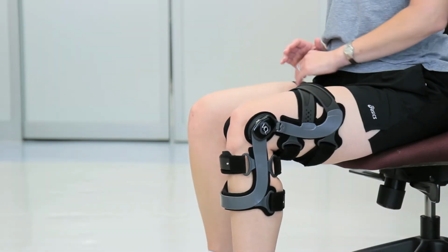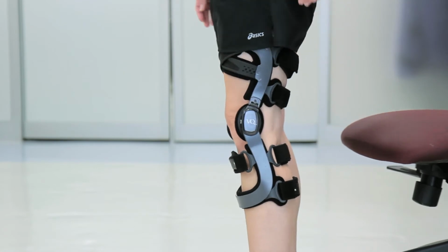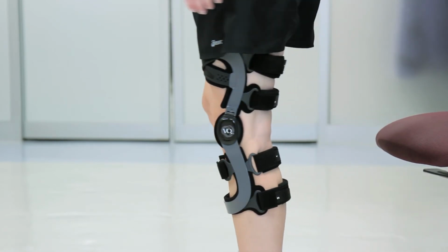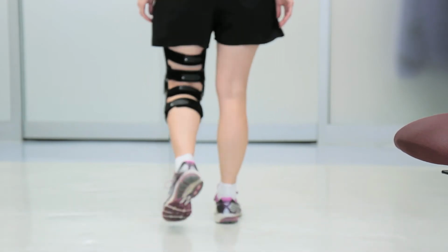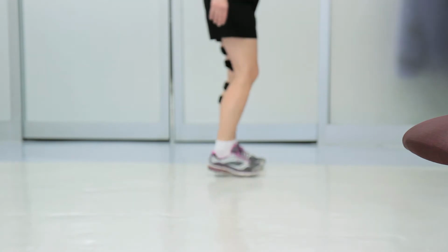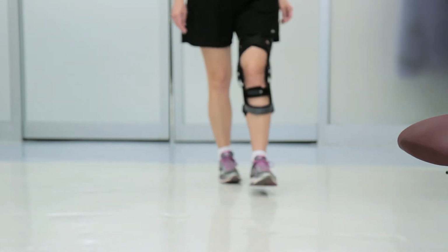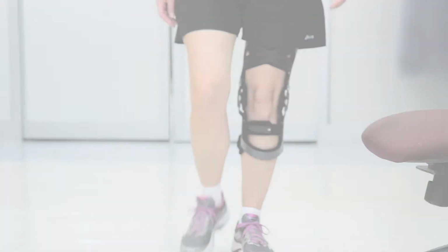Have the patient walk around a little. They should only feel a gentle pressure on the knee at the lateral condyle pad. If the pressure is uncomfortable, adjust the lateral Q-hinge back 1/8 of a turn. If the patient feels no pressure at all, try an additional 1/8 of a turn counterclockwise. Do not overcorrect, as this may cause soreness or pain.